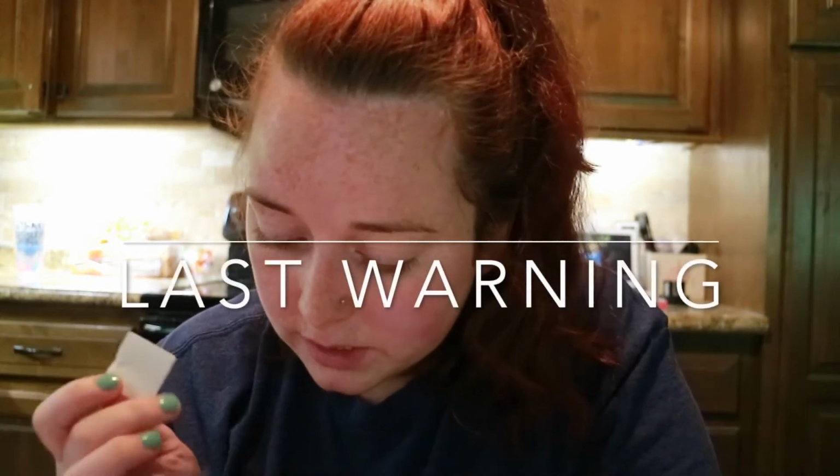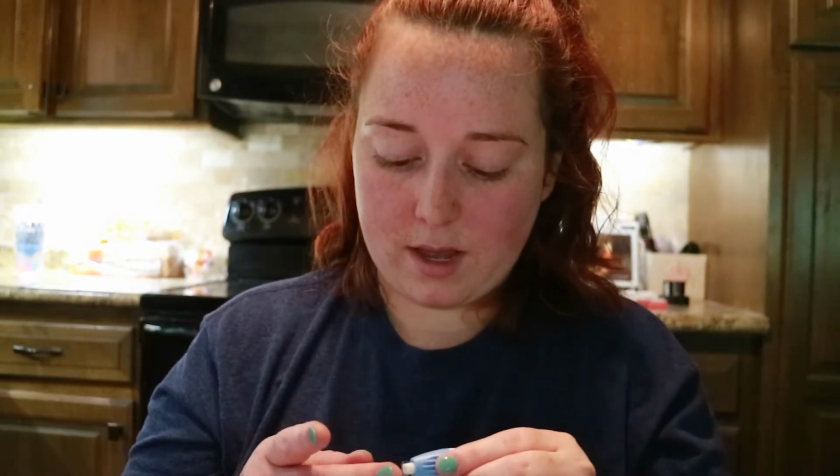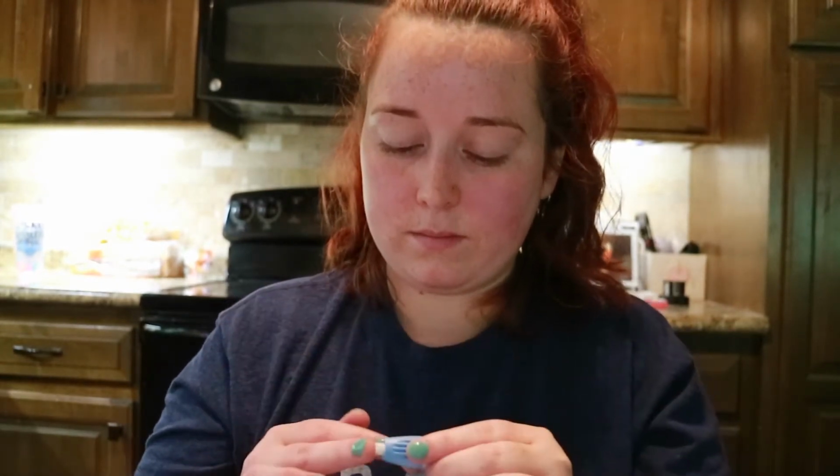Start applying pressure from the top of the finger below the knuckle to massage downward. Press firmly at the fingertip until full blood drops form. Continue massaging as needed to keep the blood flowing. It should take 2 to 10 minutes to do this. Point hand over the collection tube with the fingernail pointing away to avoid getting blood under it, for 2 to 10 minutes until the black line is reached. I hope this works. Okay, and we're just going to, I hate the anticipation.